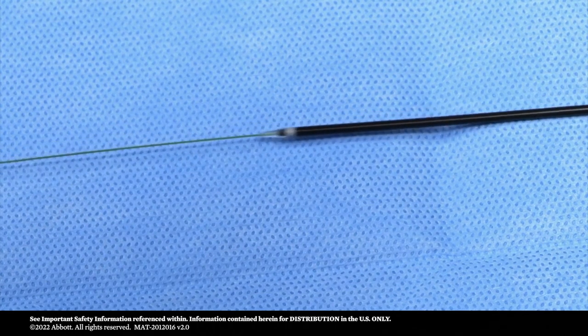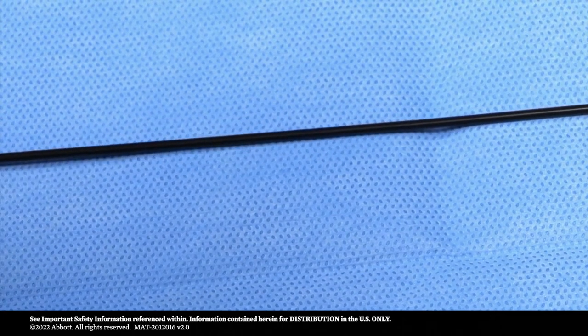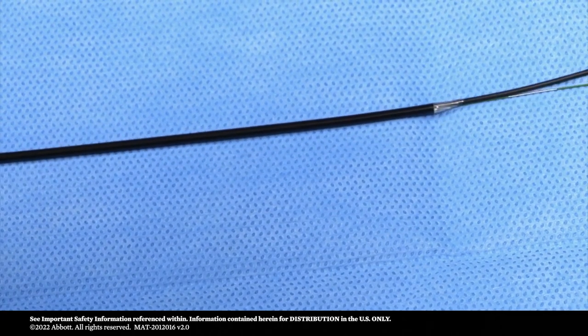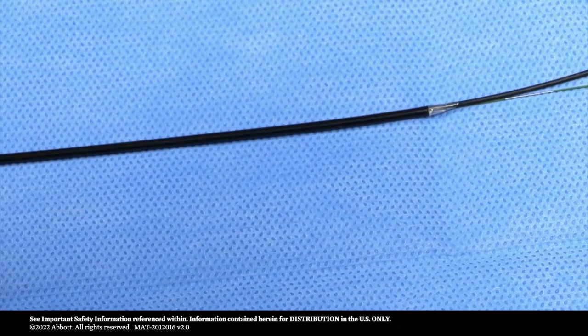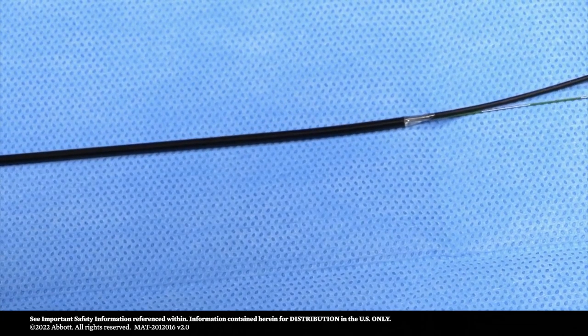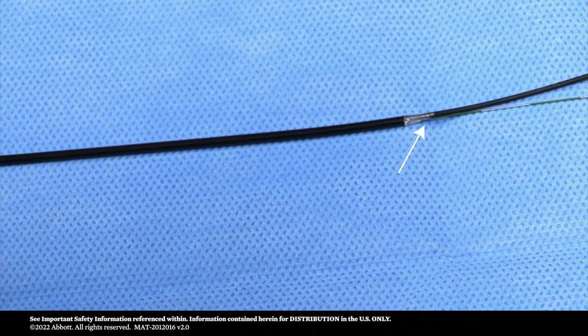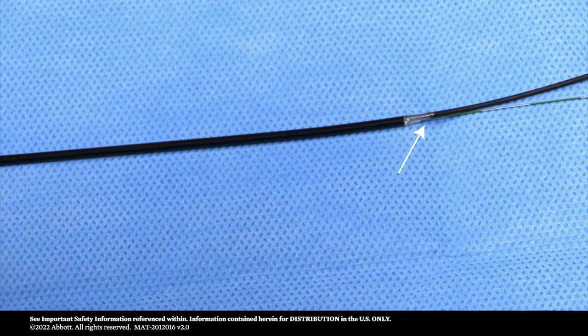Advance the exact carotid stent delivery system over the distal end of the bare wire filter delivery wire as shown. Please note, the bare wire filter delivery wire will exit the guide wire exit port of the delivery catheter as shown. Using fluoroscopic guidance, continue to advance the stent until it is proximal to the lesion.